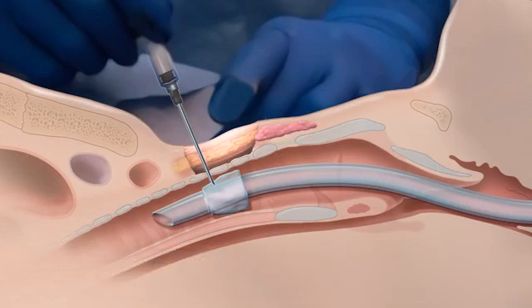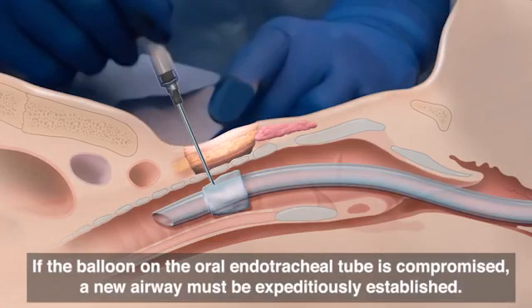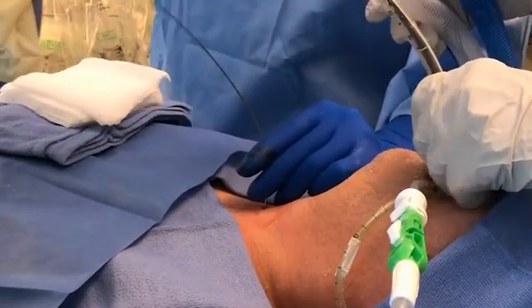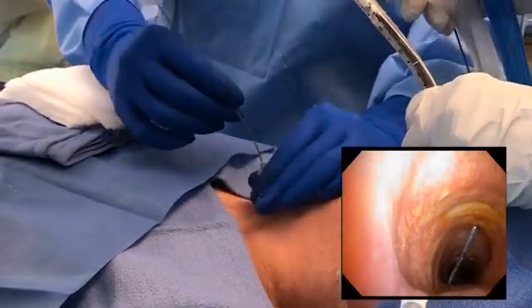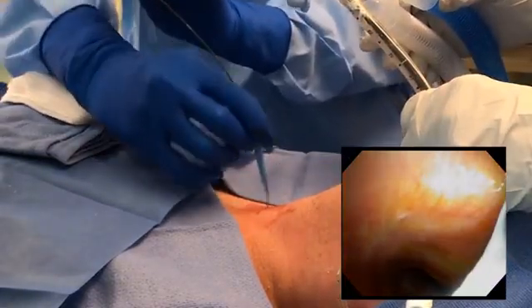In the event that the patient's condition becomes clinically unstable, or there is difficulty performing the tracheostomy while the balloon is intact, the oral endotracheal tube is simply advanced to its original location and normal ventilation is resumed. Additional supplies or personnel can be gathered. If the balloon is compromised, so too is the ability to provide positive pressure ventilation, and a new airway must be expeditiously established by means of either a tracheostomy or oral endotracheal intubation. Feed the guide wire through the needle and visualize it while advancing it distally toward the carina. Remove the needle over the wire, keeping the wire in the trachea at all times.